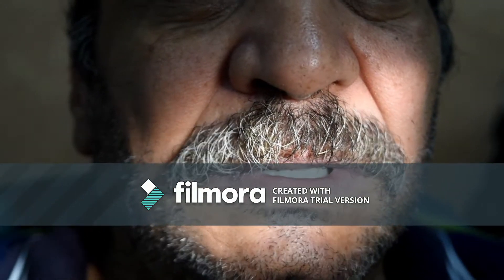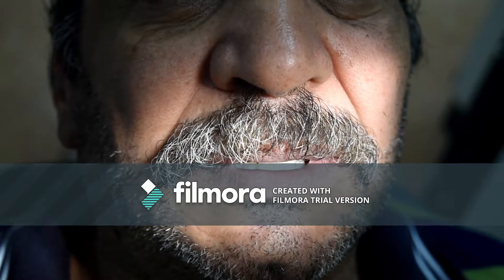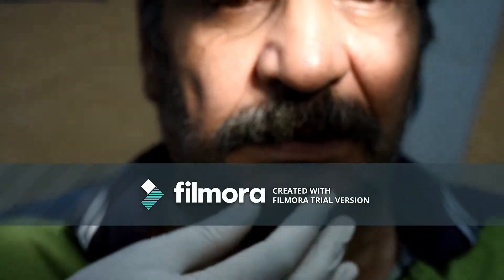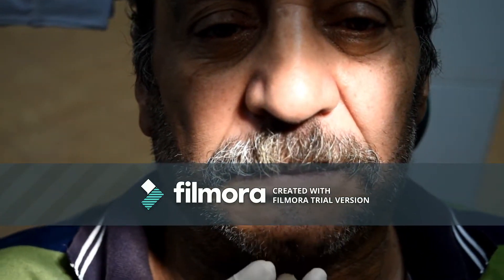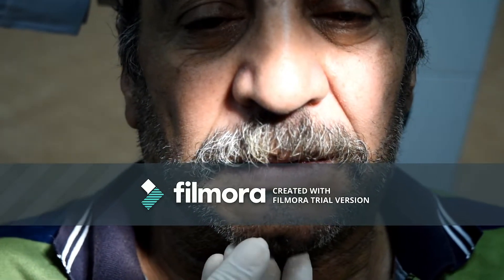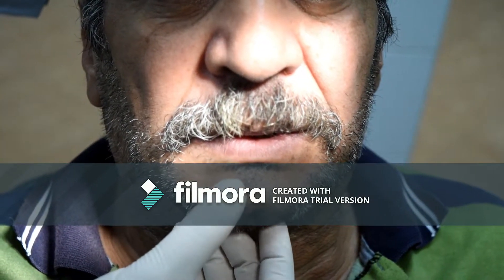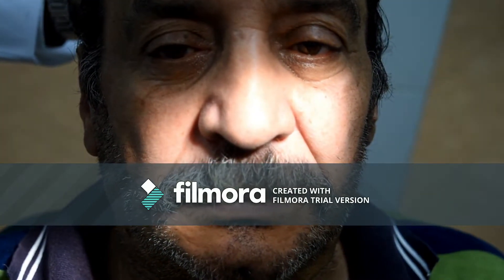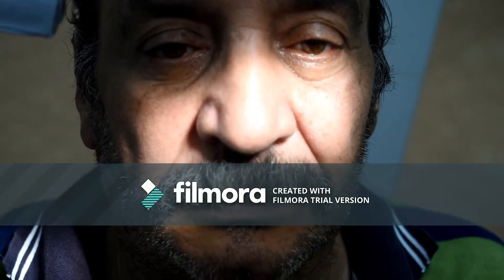Both trial denture bases should be checked together. You have to check three things: the vertical relation, the centric relation, and the even bearing. Regarding the vertical relation, you should ask your patient first to say 'M.' The patient's lips should touch lightly when he says 'M.' He should have a normal appearance, without a stretched tight appearance or a senile appearance. You can check the vertical dimension using any of the techniques used during the measuring of the vertical dimension of centric occluding relation.